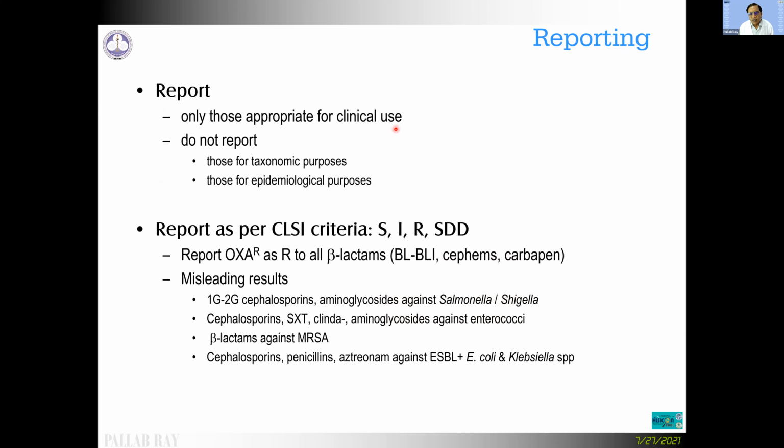Okay, now I am coming to the end of my presentation, reporting. Report only those antibiotics which are appropriate for clinical use for this particular syndrome at that particular site of infection for the organism that you are testing. Do not report those which are meant for taxonomic purposes or epidemiological purposes. Sometimes you also have isolates from non-living surfaces, surveillance things. We do not report them in the same way.